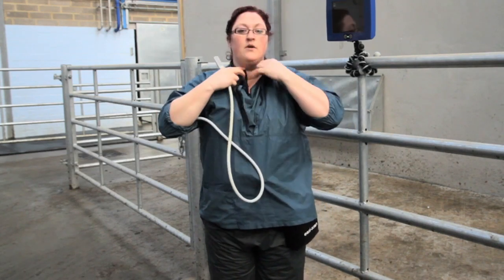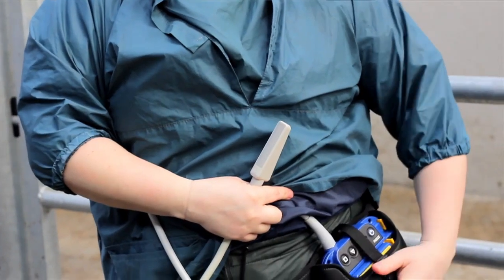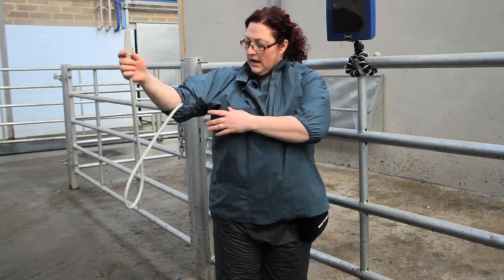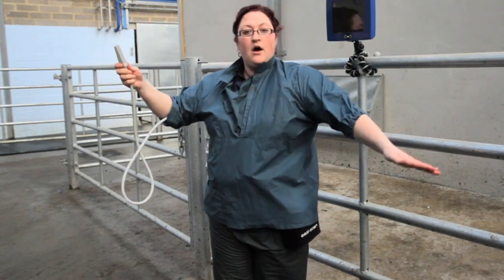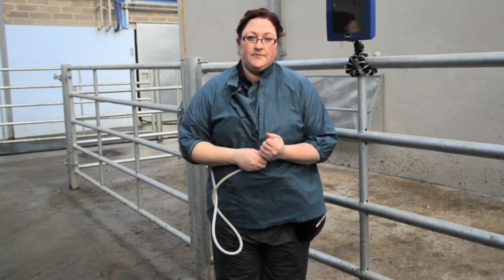Now, we have our waterproof top. We've covered over the console. And we're at less risk of the ultrasound probe flapping around and potentially becoming damaged. Now we're ready to go and prepare our cows.